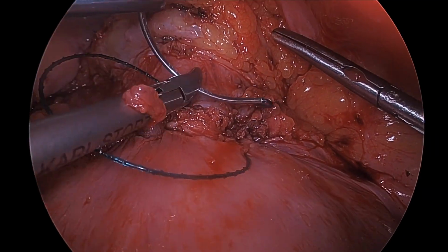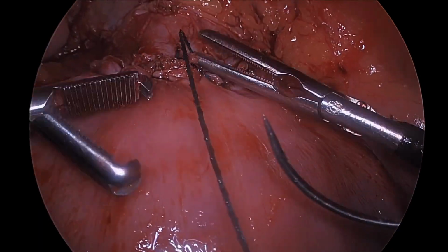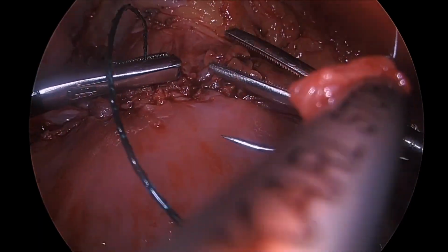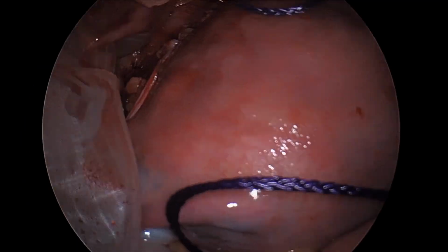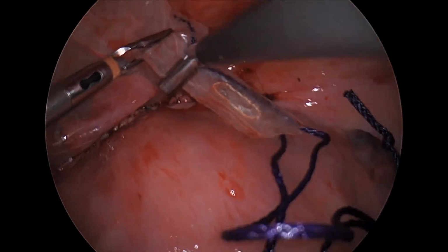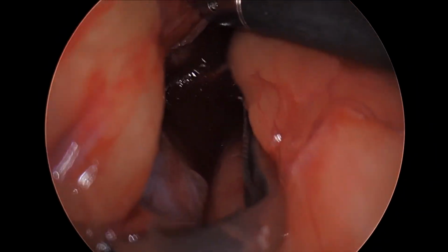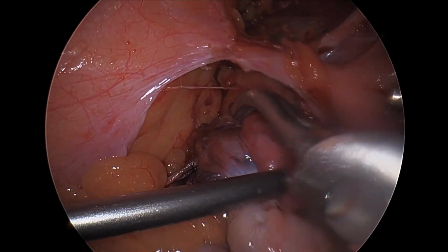A barbed suture was used to close the hysterotomy in a double-layer approach. This patient desired future fertility, and therefore strong closure of the defect was of utmost importance. The specimen retrieval bag with the pregnancy and the isthmocele tissue was then removed through the 10mm umbilical port. The bulldog clamps were then taken off bilaterally with great care to not disrupt the internal iliac arteries. Hemostasis was confirmed abdominally at low pressure as well as vaginally.